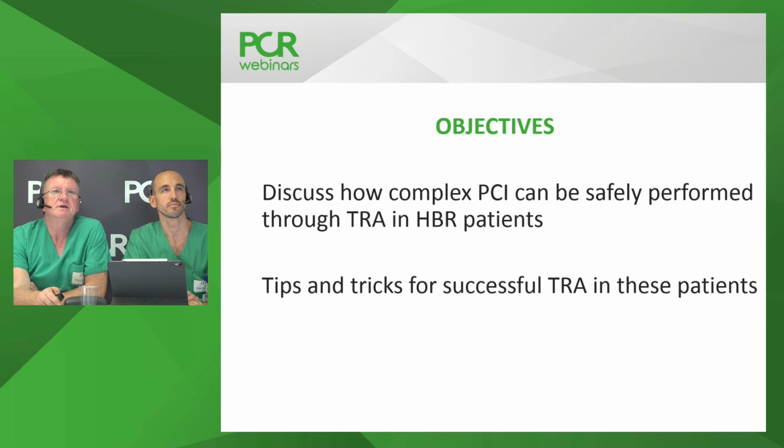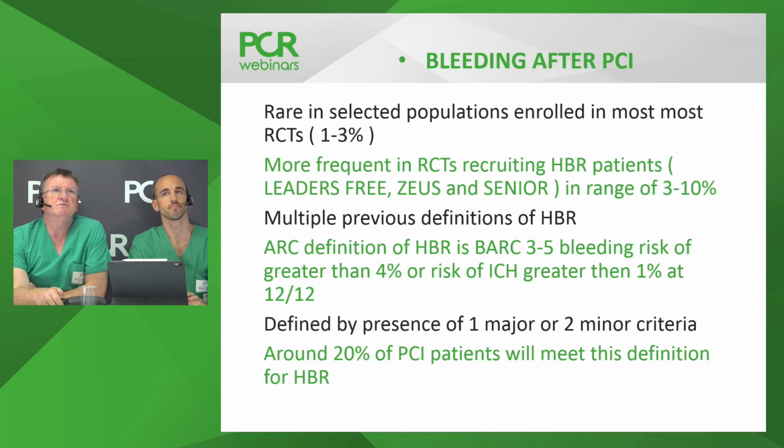The objectives today are to discuss how complex angioplasty can be safely performed through radial access in patients who are at high risk of bleeding, and to review tips and tricks for successful radial procedures in these often complex and demanding patients. I just want to start by reviewing some issues around the question of bleeding after angioplasty.